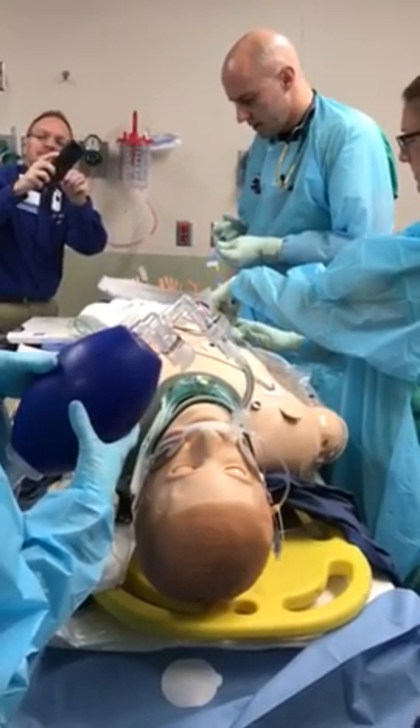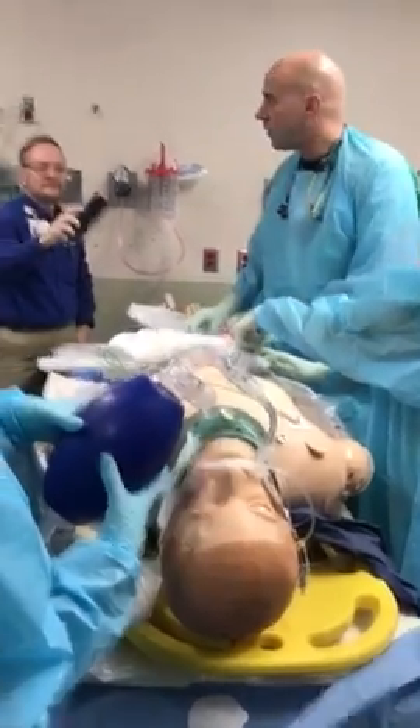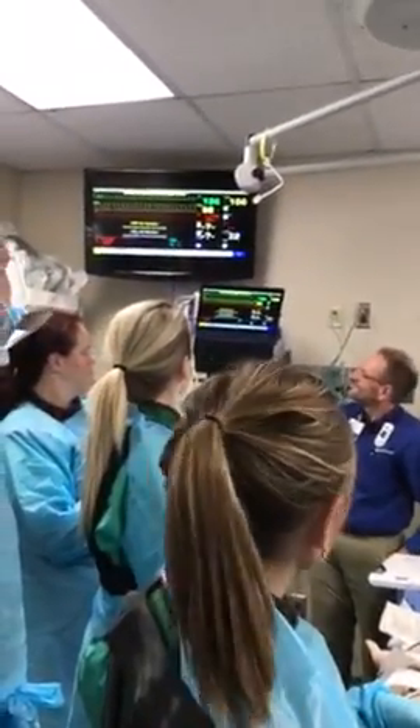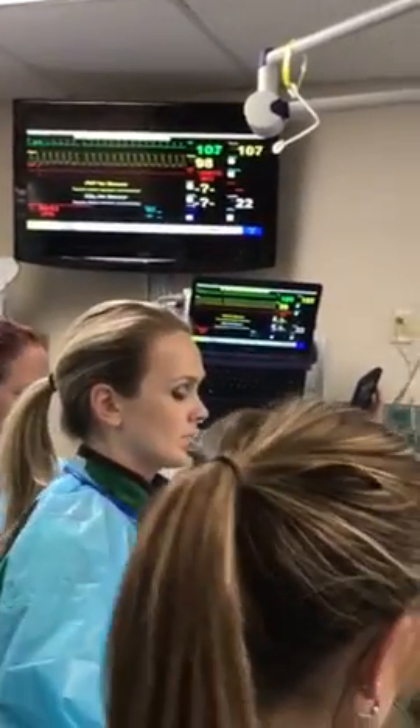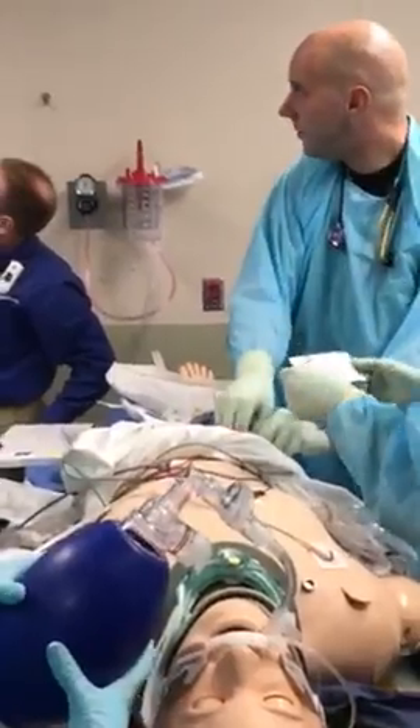10 in. 15. Lock that down. See what our pressure is — see if it rises for us. Can we get a secure mitt as well? Lock that for about 4 minutes.